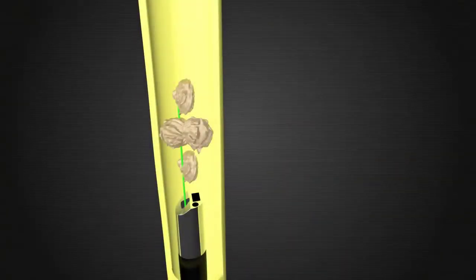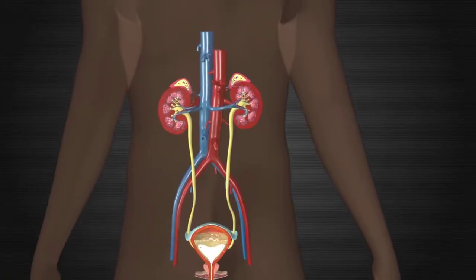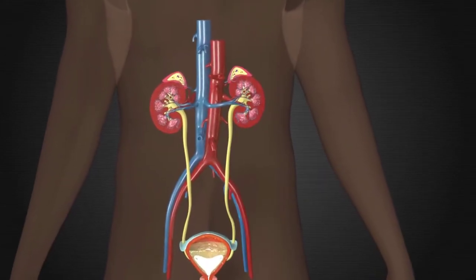If there are several pieces, we will use a small basket fed through our scope to pull them out one at a time. In some cases, your stone may be small enough to remove with the basket without using the laser at all. Once we believe we have removed the stone, we will take another look in your kidney to make sure we didn't leave any pieces behind.